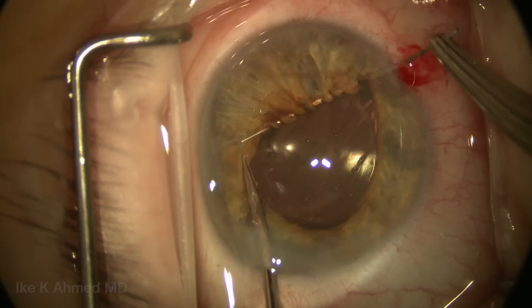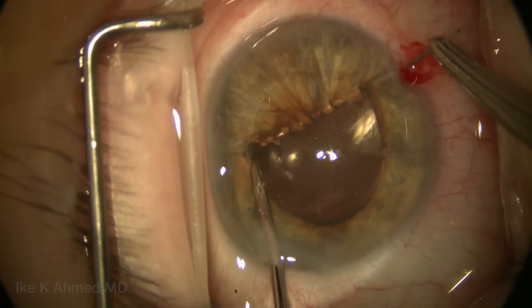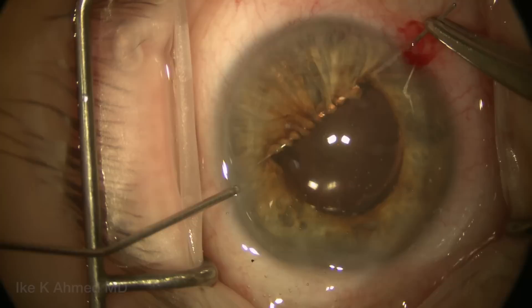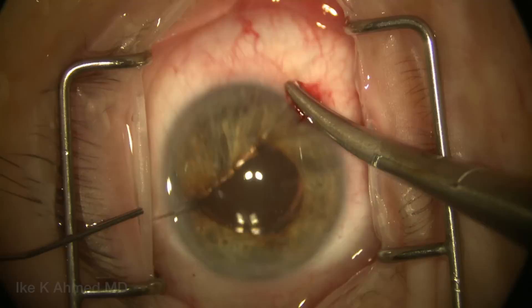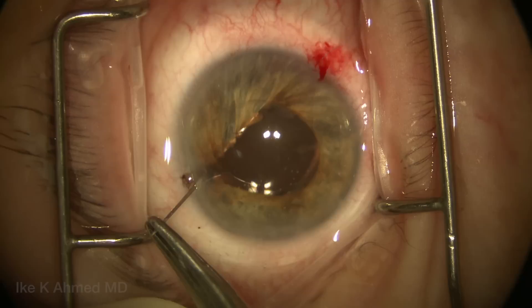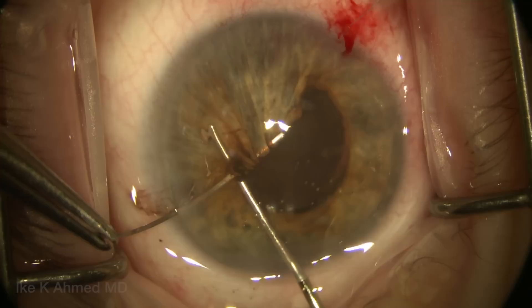It's helpful to grab the needle very close to the swage to allow enough needle length in the anterior chamber to grab as much iris tissue as possible. Toward the end of this first pass — the most challenging aspect — we prevent rotation of the needle or iridodialysis. We dock the needle to a 27-gauge cannula and push and pull the needle out through that paracentesis, watching carefully for excessive traction on the iris tissue. We remove the needle with the needle driver following the natural curve of the needle, using a Kuglen hook for counter-traction. This completes approximately one-third of the nasal and supranasal iris.